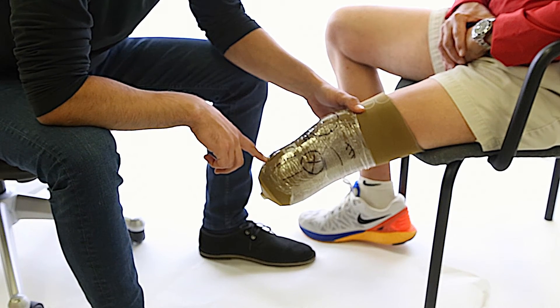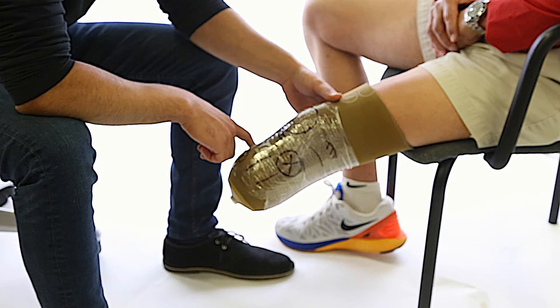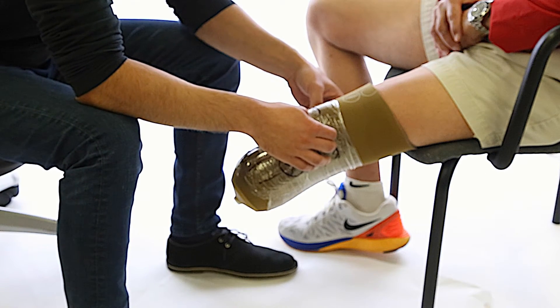We also mark the borders of the tibia, the distal end of the tibia, the medial tibial plateau for medial tibial load bearing, the femoral condyles, and proximal to the condyles for compression.